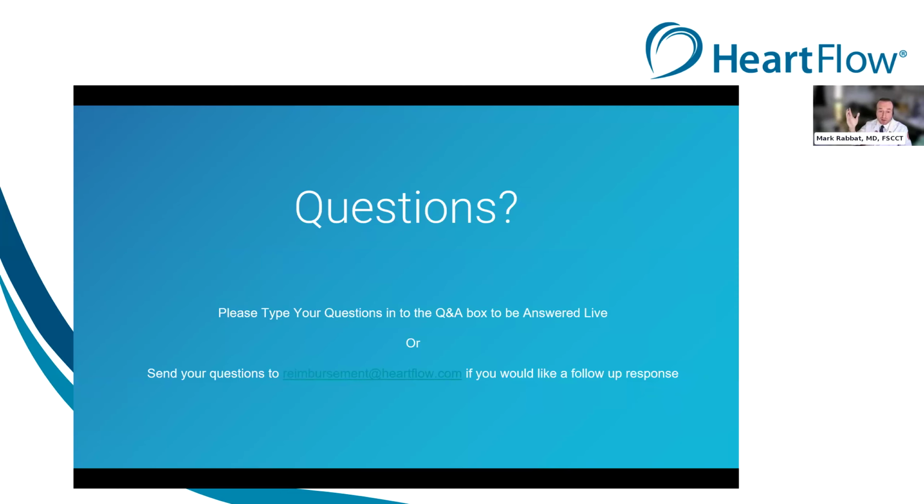So I've had many patients over the years, Cara, who based on their CT scan were found to have multivessel disease and were recommended for coronary artery bypass graft surgery. So surgery based off of the anatomic assessment on their CT. But after having the information from FFRCT and the physiology, they were actually downgraded from a more invasive and costly coronary artery bypass graft surgery to a single vessel PCI and stent. And I've been following these patients for nearly a decade now, and they're doing great with this strategy.